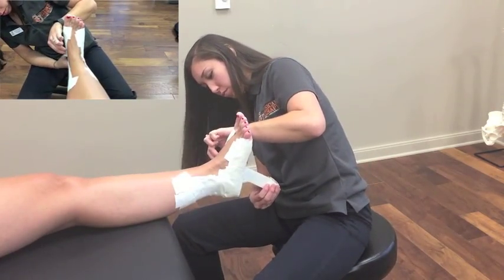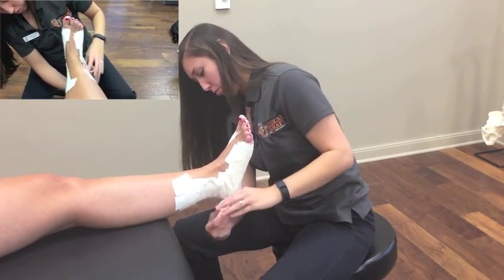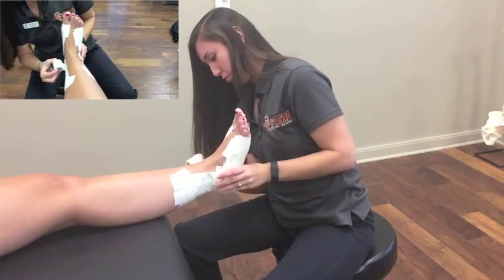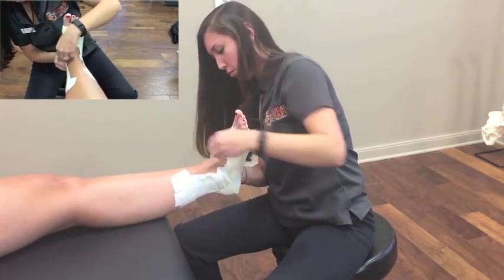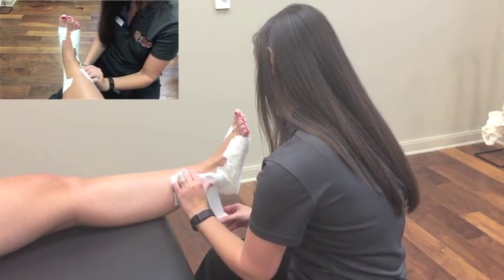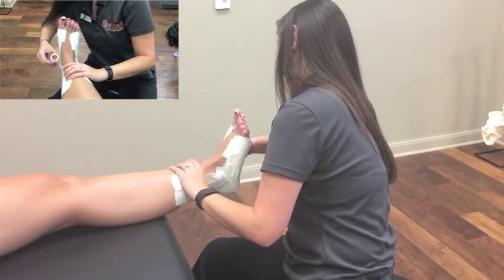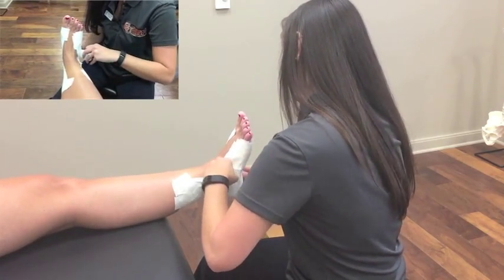Now that the exposed areas are completely covered, the next step is to apply the heel locks. The lateral heel lock starts by placing the tape on the medial side of the foot, then crossing under to the lateral side, wrapping behind the heel, and onto the medial leg, continuing to leave the anterior portion exposed. The medial heel lock starts by placing the tape on the lateral side of the leg, crossing behind the heel towards the medial side, and then back up on the lateral side of the foot.